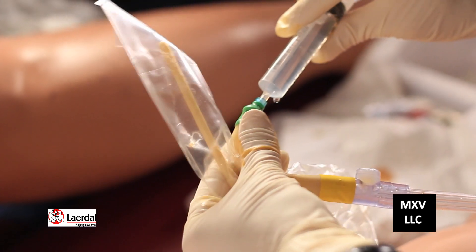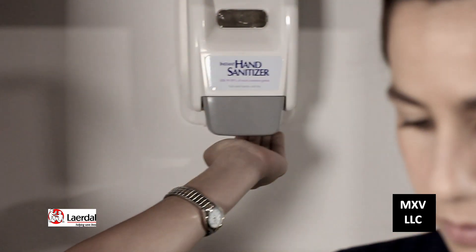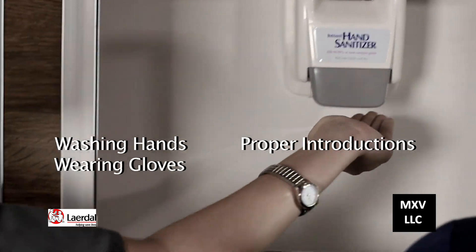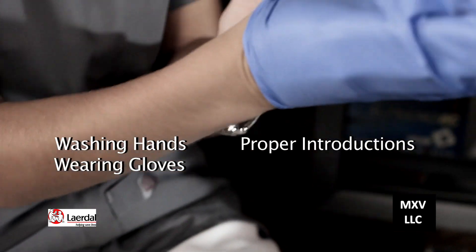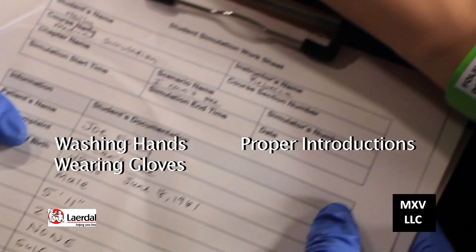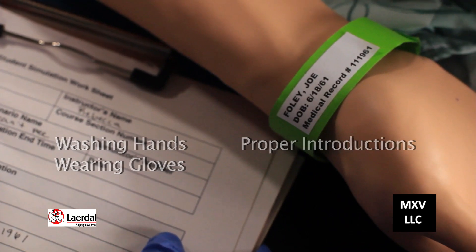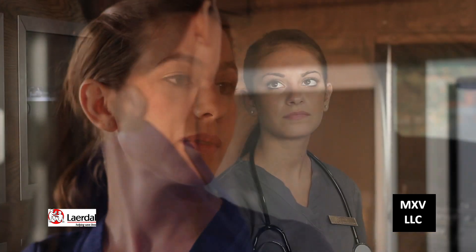Along with the essential skills, your instructors will be looking for washing your hands, wearing your gloves, and demonstrating a proper introduction to your patient, including checking the patient's name and birthday on the ID bracelet with that of the medical records. Now let's join our healthcare professional Rebecca and her student Holly as we learn how to insert a Foley catheter.